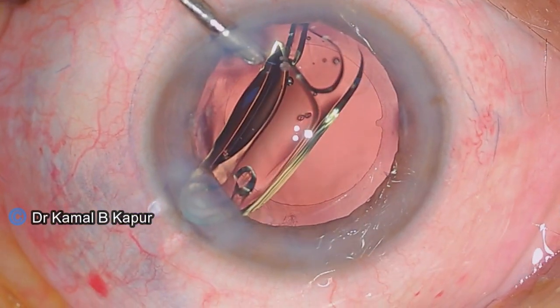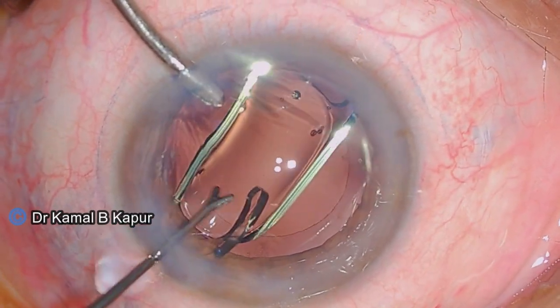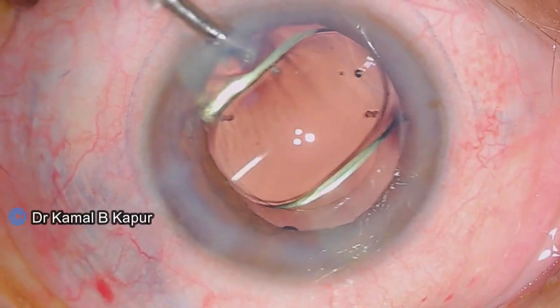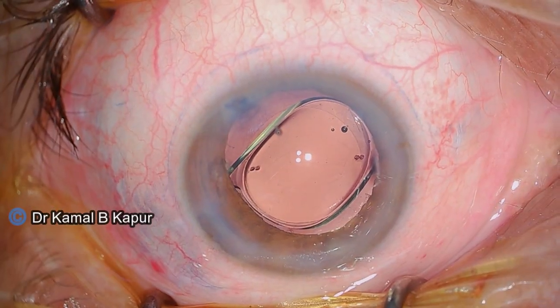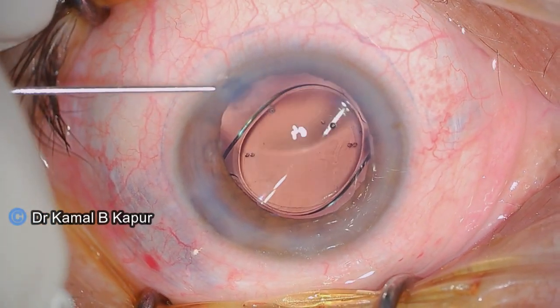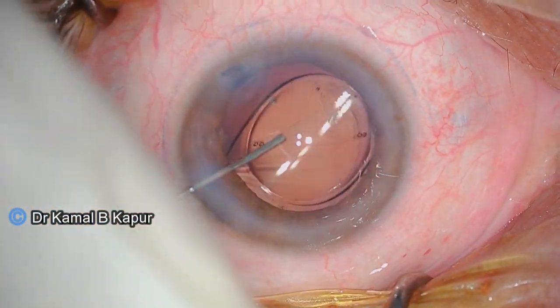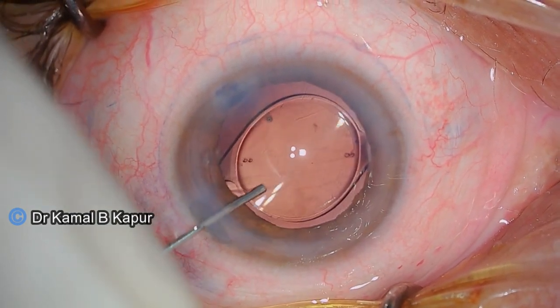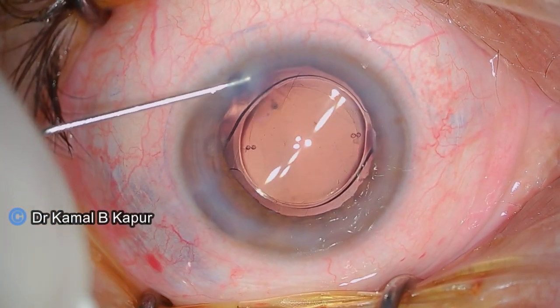We implant the IOL in the eye using the hydro insertion technique. The IOL is pushed into the bag and all we need to do is align the toric markings of the lens to the exact nubs created on the capsule rexis margin — the IntelliAxis. This ensures very accurate placement of the IOL within the bag, and even the chances of misalignment due to parallax can be taken care of.